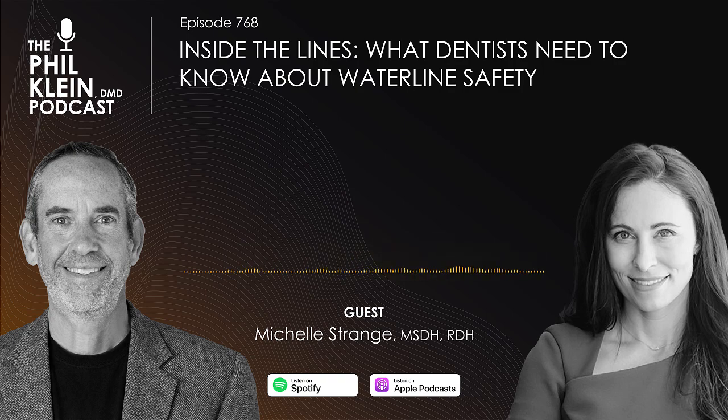So it really just depends on how often you should be changing these. And that will be giving you this continuous silver ion through the water lines. From the standpoint of compliance, let's talk about compliance versus cost. I don't know the answer, but my guess is that the cartridge straw is more expensive than the tablets, but requires less compliance. Is that right? Yeah, I think that's a decent way.